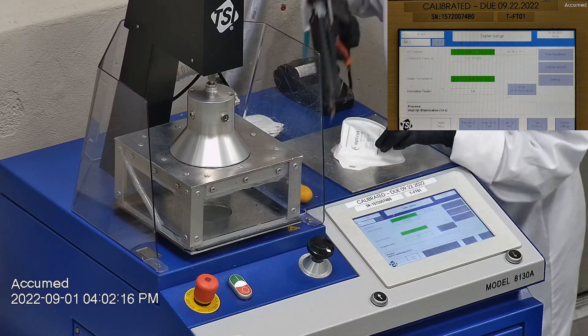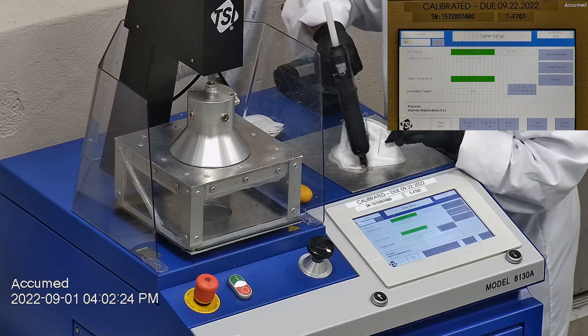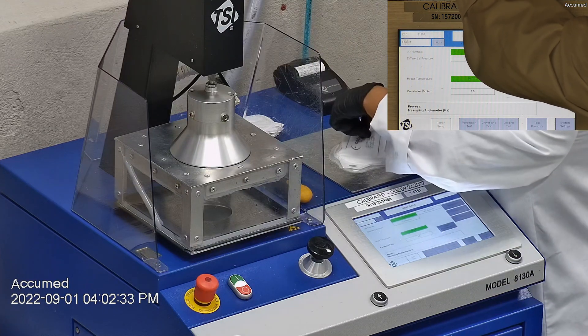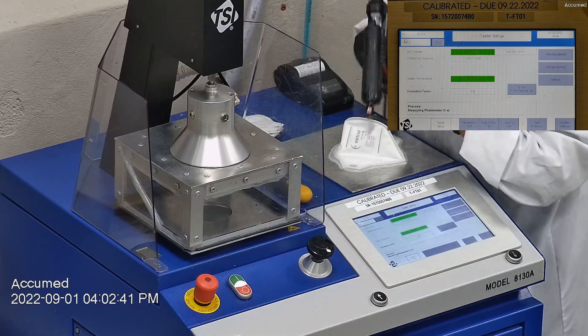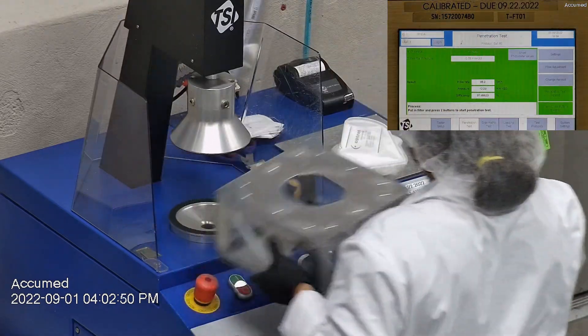Then we make sure that the mask is properly and completely sealed with hot glue to the testing plate. When applying the hot melt glue, we make sure there are no holes or leakage around the seal to ensure accurate results. The testing plate is then attached to the frame and the box is placed under the TSI filter holder for testing. The results are displayed on the TSI monitor.